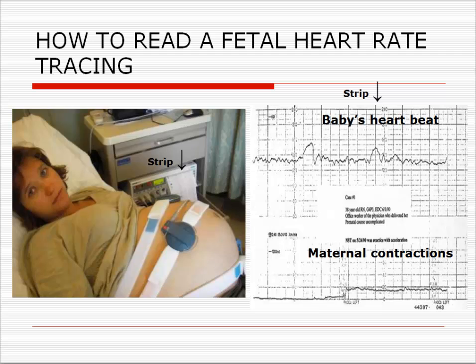Let's begin with the basics of reading a fetal monitoring strip. The pregnant woman in the photograph is lying on a bed in the triage area of an obstetric unit. She has several belts strapped to her abdomen, collecting information from the fetus and the uterus. Notice the strip of paper coming from the machine on her left — this is the fetal monitoring strip. The strip records fetal heart rate and uterine activity over time. The top half of the strip corresponds to the fetus's heartbeat, and the bottom half displays maternal contractions over time, although no contractions are seen on this fetal strip.